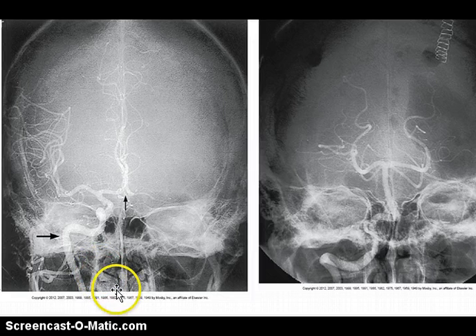Okay, this picture does show the bony landmarks, so it's not digitally subtracted. So this is an internal carotid artery. Again, it bifurcates into the anterior cerebral, and then this is the middle cerebral artery. So that's a good picture.